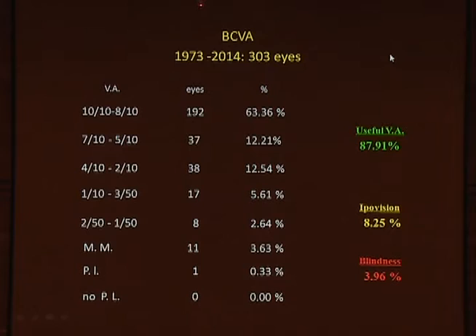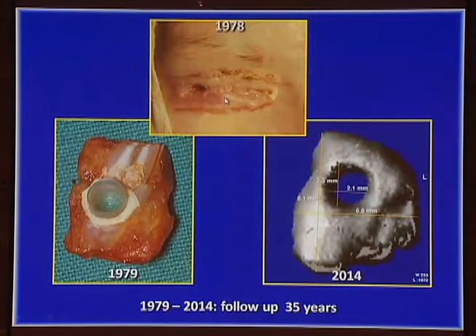This is the longest follow-up. This woman was attacked by a friend in 1978, the lamina. This is the scan of the lamina, which is still in excellent condition. So the follow-up is 35 years. She's still doing well, she still has good vision. And this is the longest follow-up of our cases.